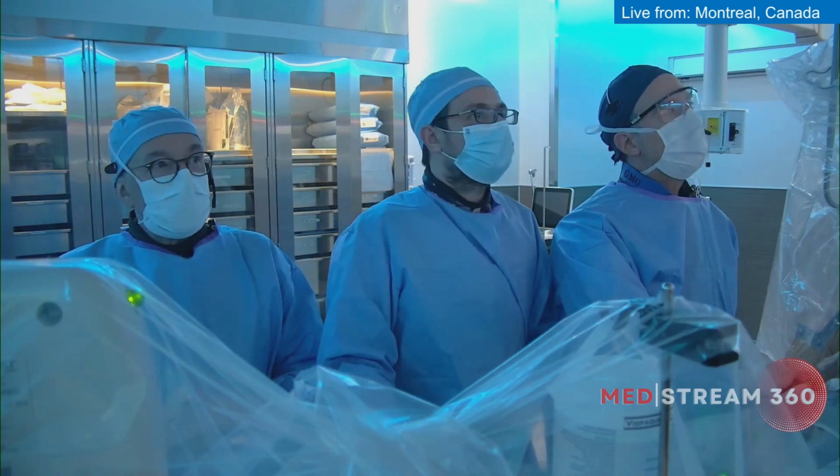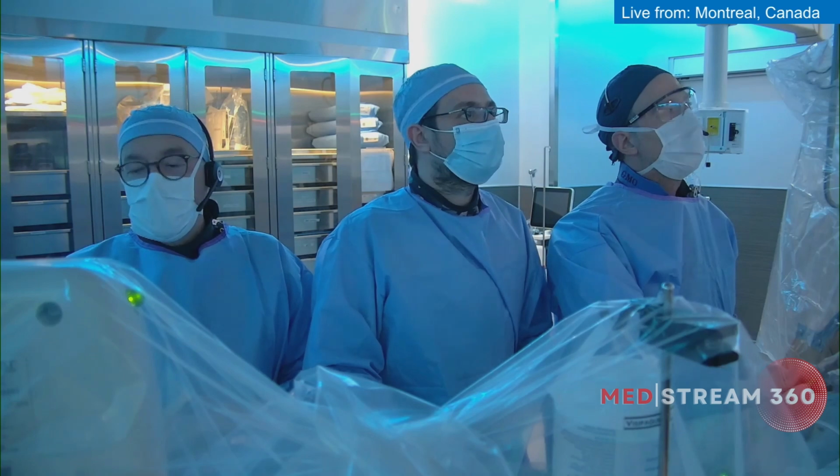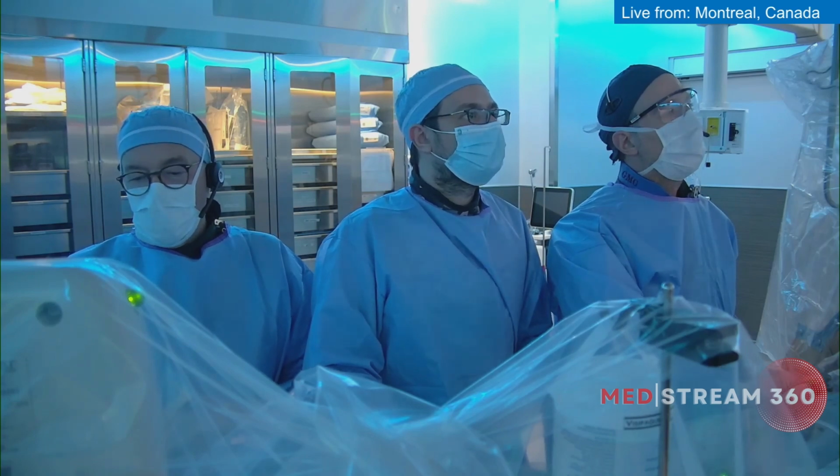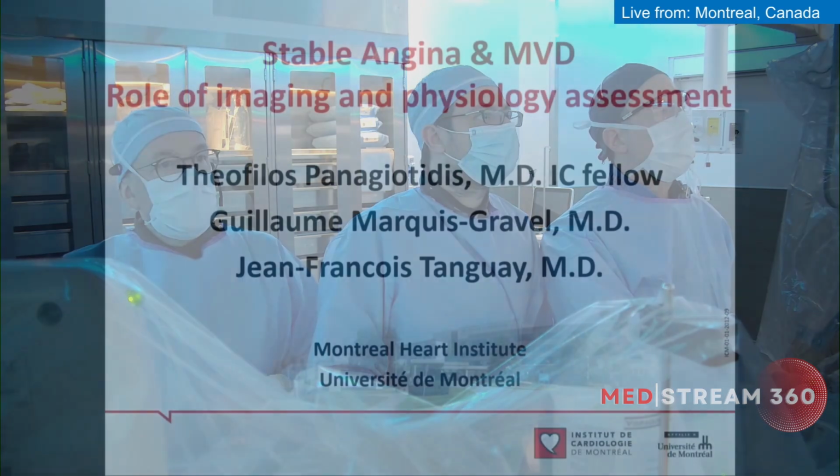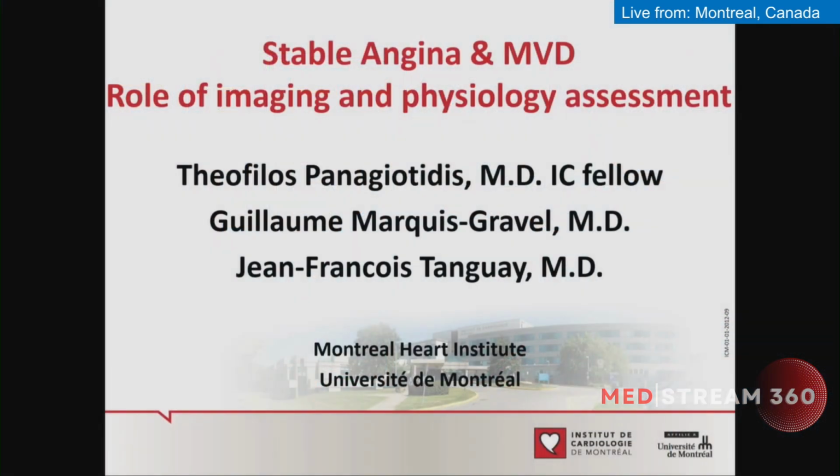We have an interesting case to discuss with you today of stable coronary artery disease, but multivessel, in a 60-year-old man. Again, what we would like to discuss as teaching objective is the role of imaging versus physiology, or maybe sometimes both in some specific cases.